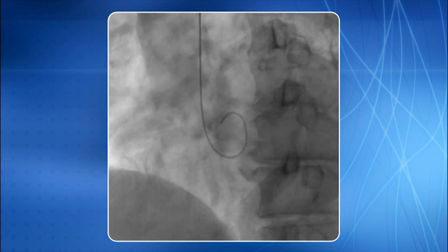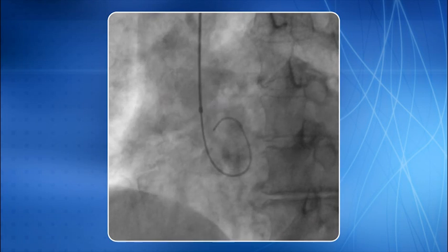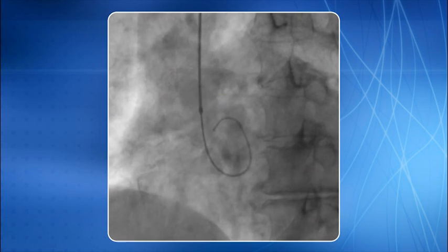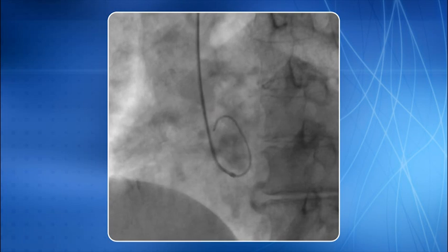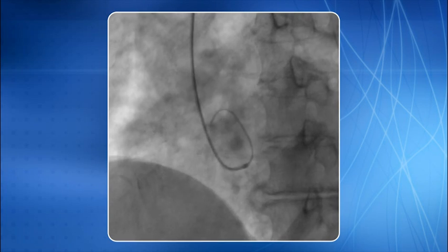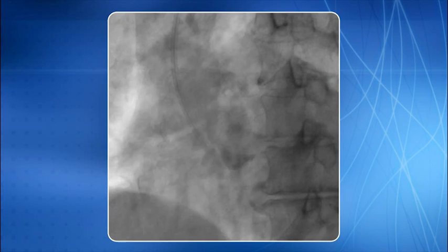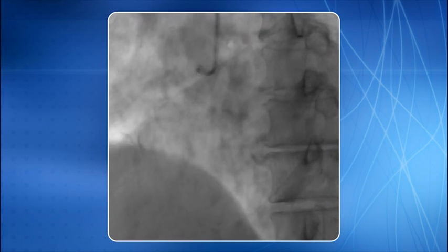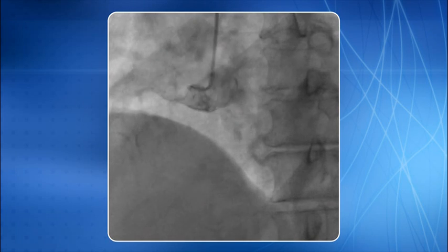The left Judkins catheter is removed over the wire. The right Judkins diagnostic catheter is negotiated over the wire and brought above the aortic valve. The wire is pulled back inside the catheter. The catheter is slowly rotated clockwise. RCA cannulation is done.